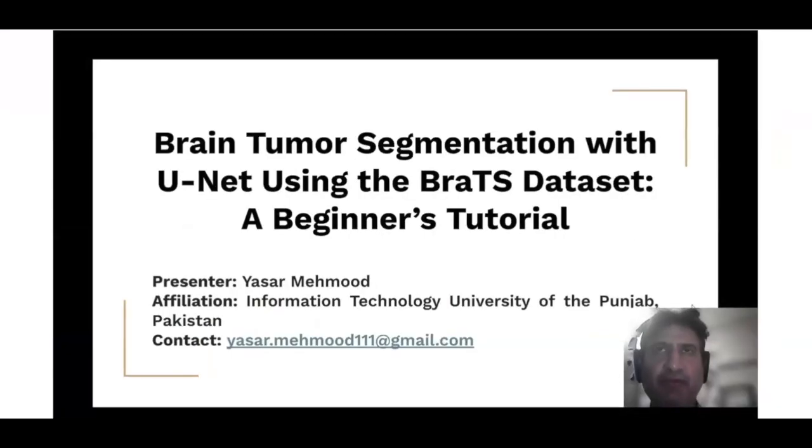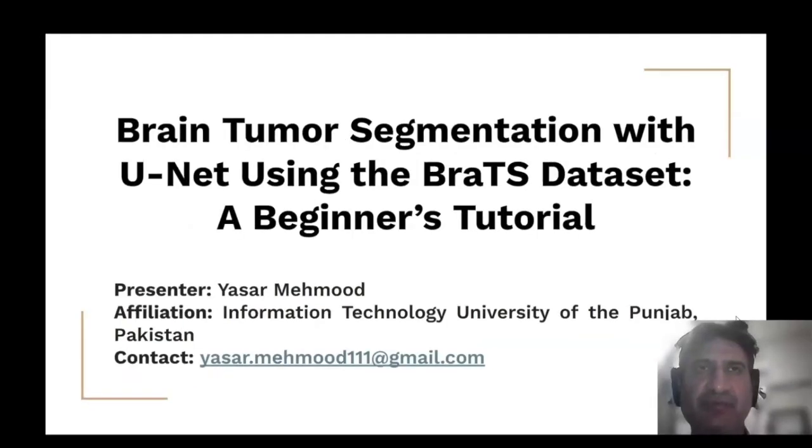Hello everyone and welcome to this tutorial on brain tumor segmentation. My name is Yasar Mehmood and I'm a teaching fellow at the Information Technology University of the Punjab. Today we are going to bridge the gap between medical imaging and deep learning by building a pipeline to segment gliomas using the U-Net architecture and the BraTS dataset. Whether you are a student or a researcher, this session is designed to give you a hands-on end-to-end experience in medical AI.